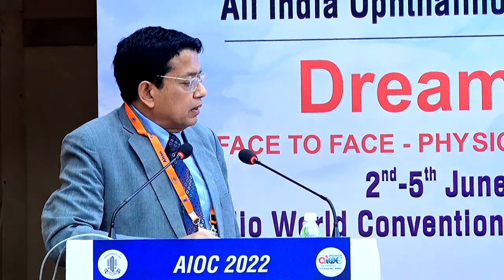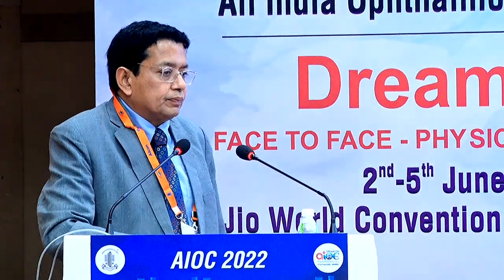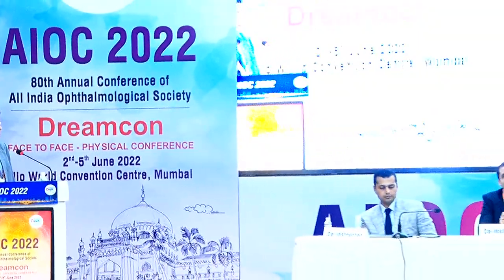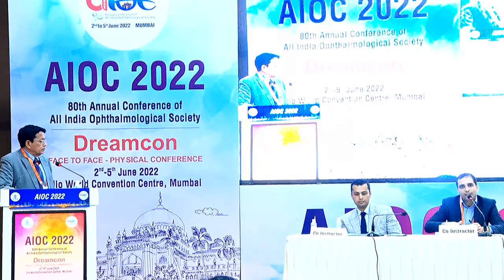Correct. So I think the take-home message is: don't chase the steep axis, as sir very correctly showed. Astigmatism is not just magnitude, it is also axis. So the vector relationship doesn't go as linearly as saying that if you make a superior incision, it will flatten more and things like that. So stick to one incision, follow those refractive outcomes, and then base your cases on that.